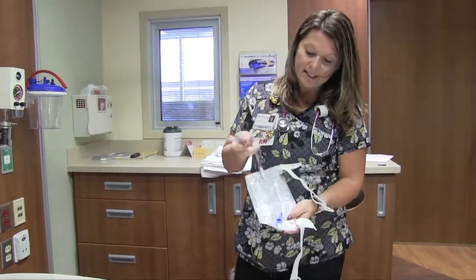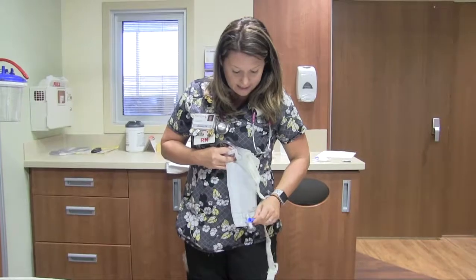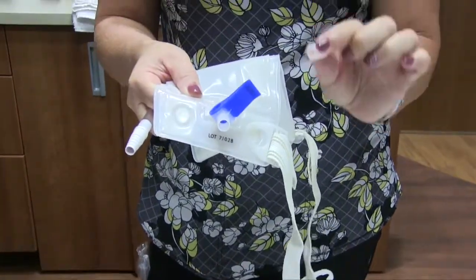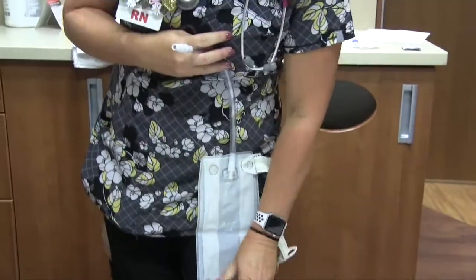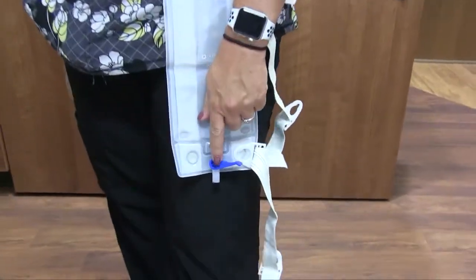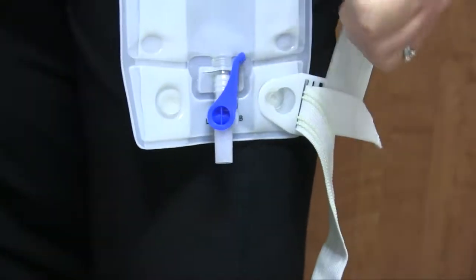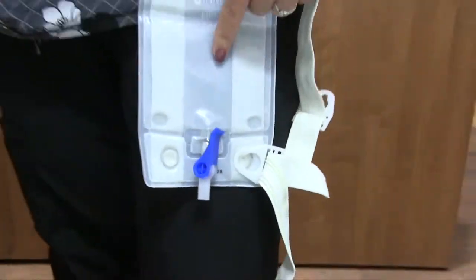This system is a little different when you empty. So the thing I like to tell patients is, again, you just have another home. This little cap at the end, again, does not stop urinary flow. It is just simply there for sanitation reasons. But while you have this on, if you notice that this is like this, it kind of looks like a foot. That means your foot's going to get wet because the system is open. This is a closed system. Thumbs up, we're good. So this is how we drain this system.